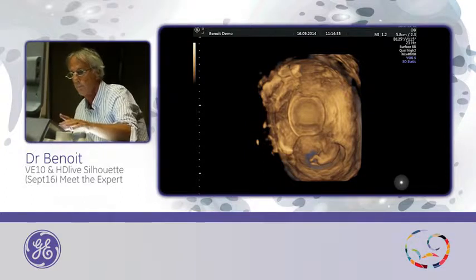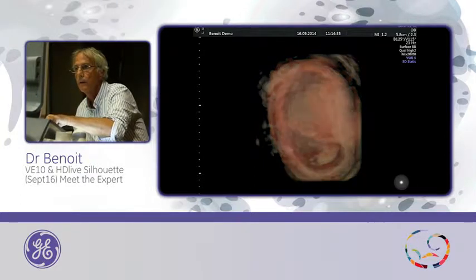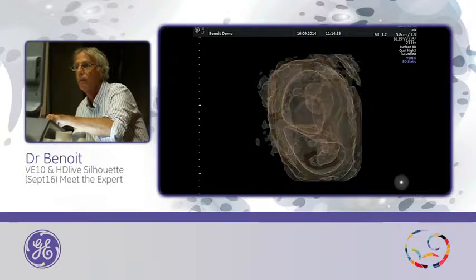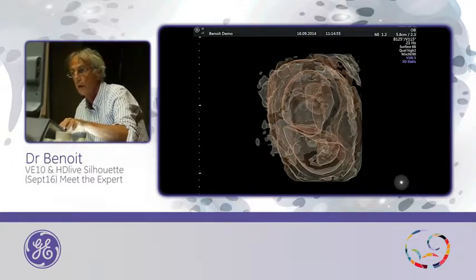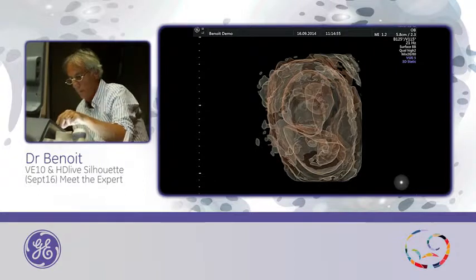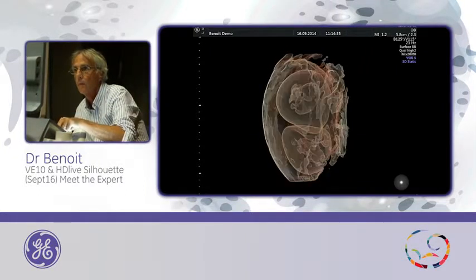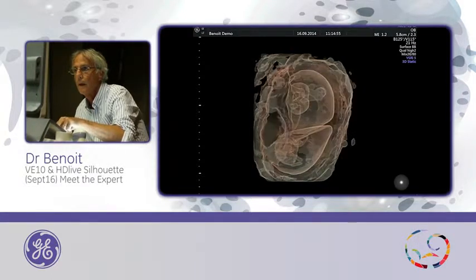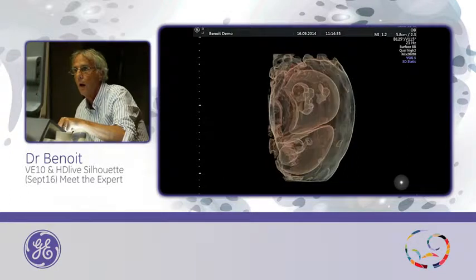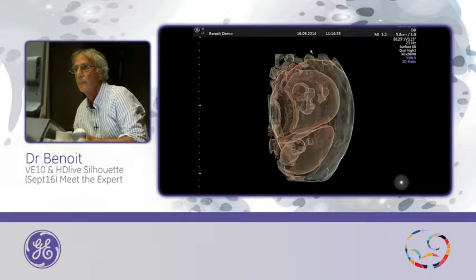I switch to HD Live. This one. Increase the silhouette. Now you can see the two gestational sacs. We move around. And I choose the best view.